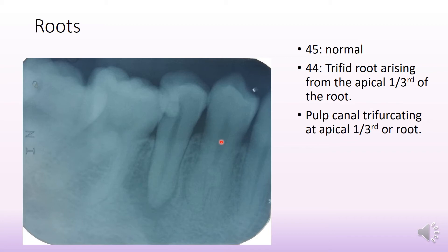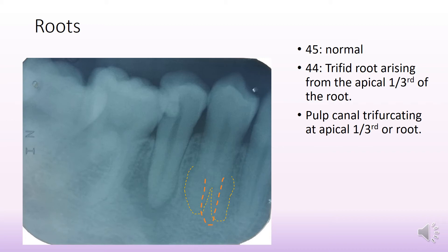When looking at the roots, it is important to note that not only the tooth of interest but the adjacent tooth also shows interesting findings. The root of 45, our tooth of interest, looks normal. However, when you look at 44 you can see the outline of a bifid root, and if you look closer you will also see the third root — and hence you are looking at a trifid root.